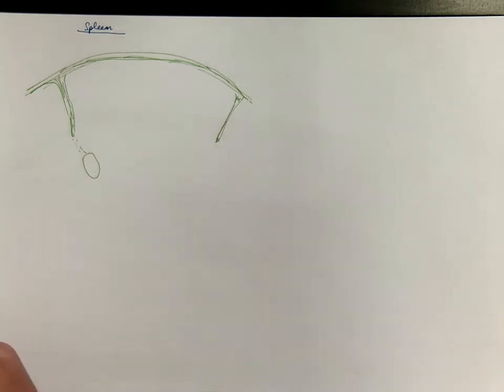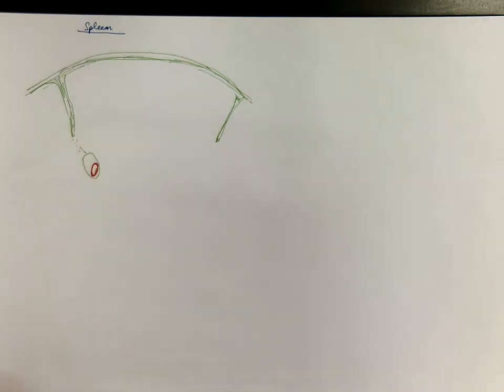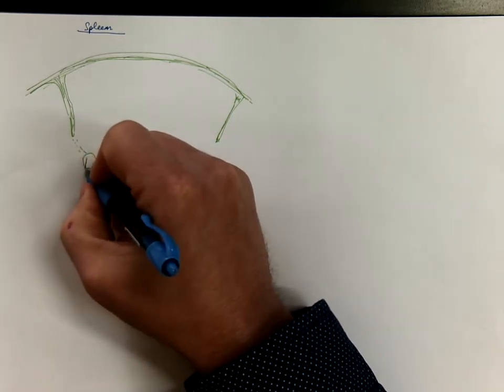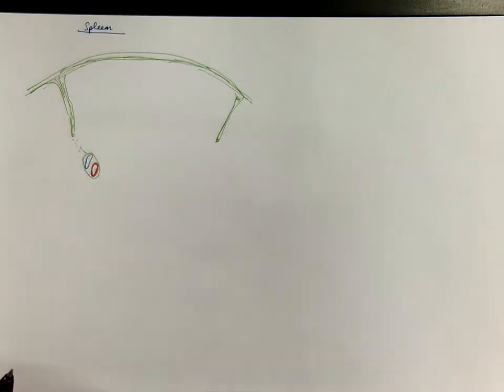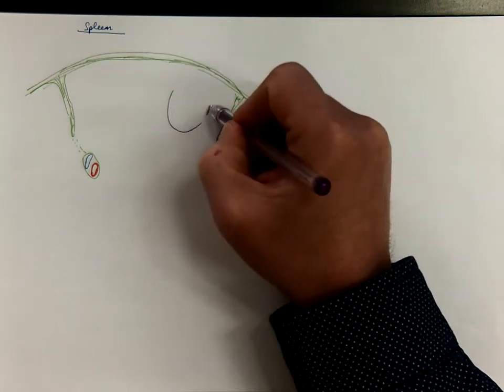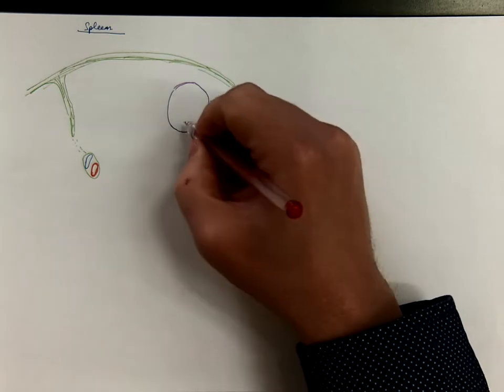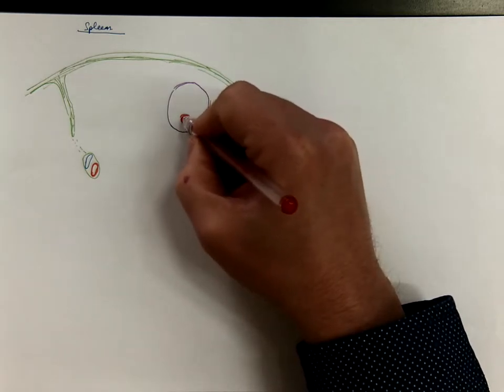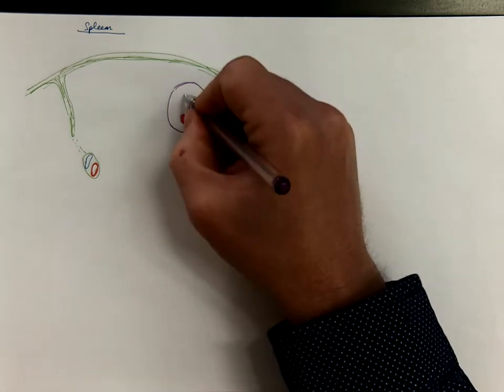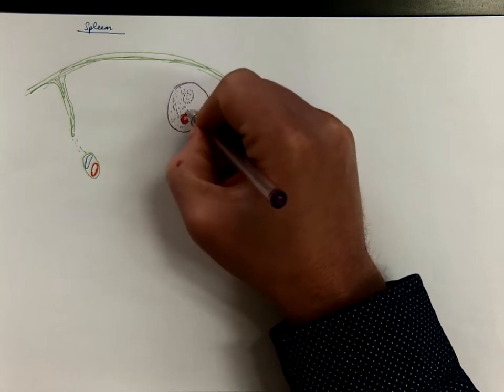That's where you will find also the trabecular arteries and trabecular veins. The inner space contains ellipsoid structures with blood vessels — these are lymphoid follicles. Mostly there is a lighter center somewhere: it's a germinal center. And otherwise there are lymphocytes everywhere.